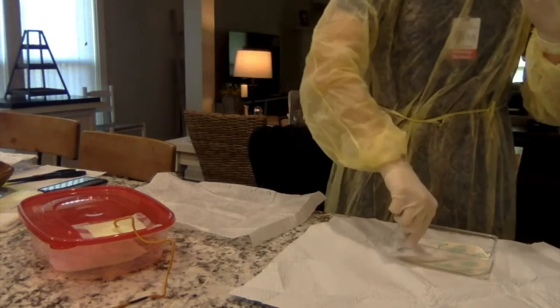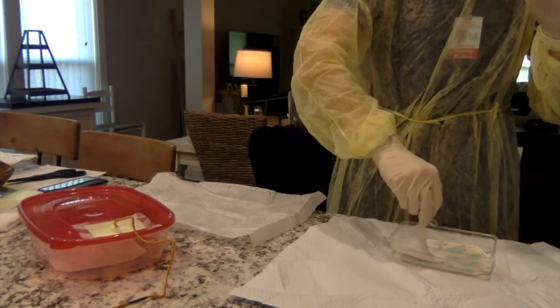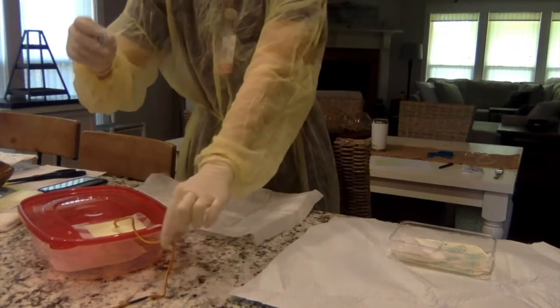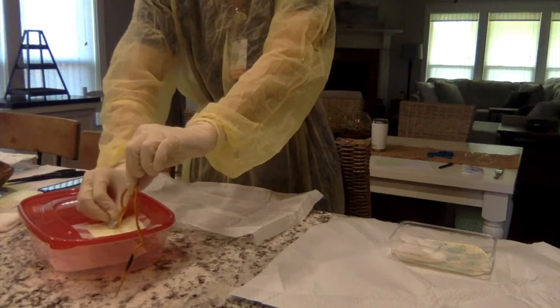So now that I have done that, I'm going to take my bio patch, and according to hospital policy, I'm going to have the blue side up, and I'm going to take my non-dominant and unsterile hand now and stabilize it and place my bio patch.